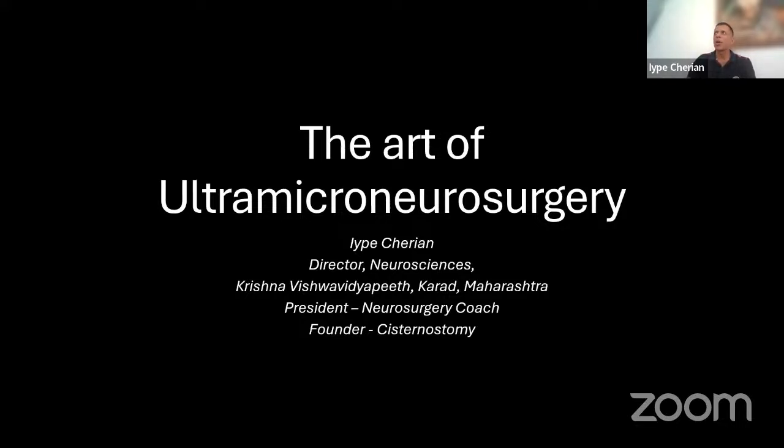Yeah, so our quest for ultra microneurosurgery started way back in 2015. And we were thinking maybe the zoom is not enough. So when we moved to a new place, the Pentero that we had, we wanted to reverse engineer it for 40 zoom. We got a ProMag from Zeiss, and that was not getting us 40 zoom. So we put a 3-step magnification changer onto the new Pentero.